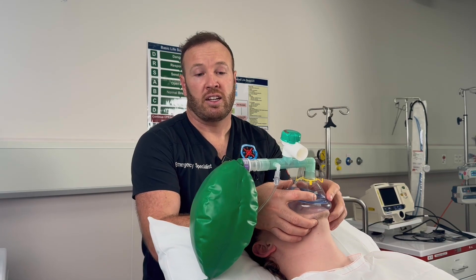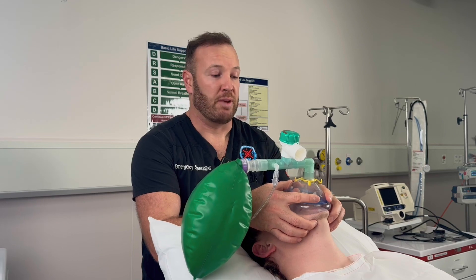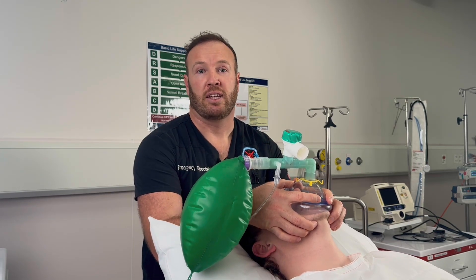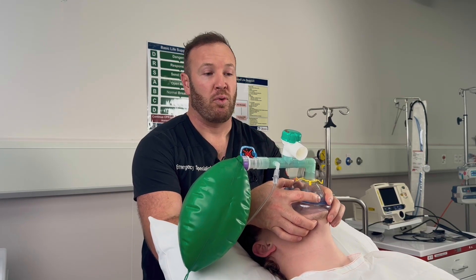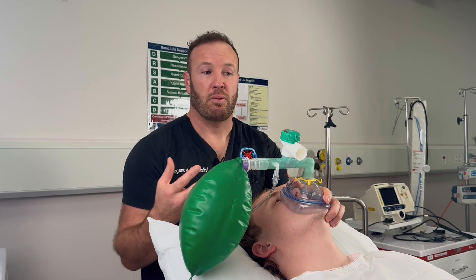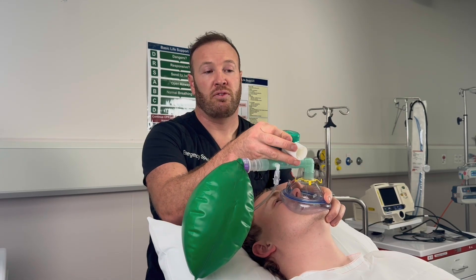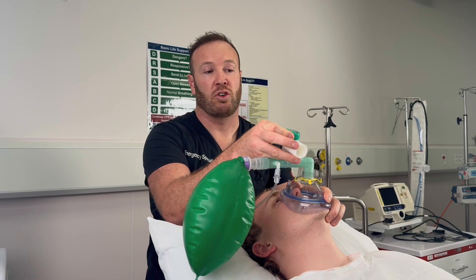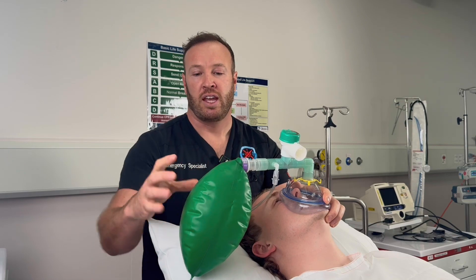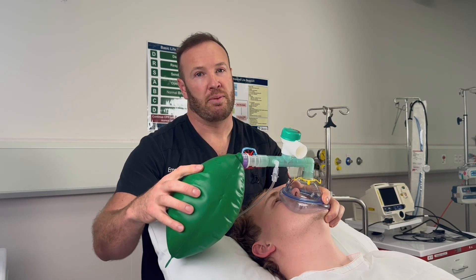If the bag stops inflating and deflating but your seal is good, that may be because the patient has become apneic. Once the patient is apneic and you want to deliver a breath, typically put a half turn or a quarter turn on the APL valve — that is going to allow you to deliver a breath to that apneic patient.